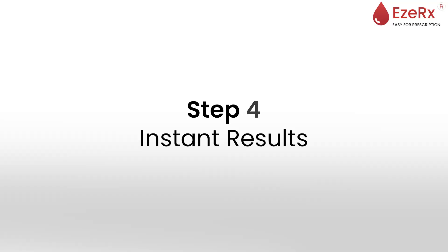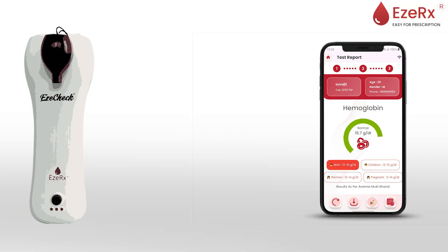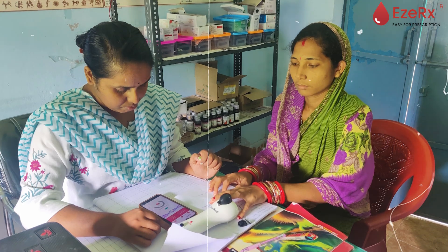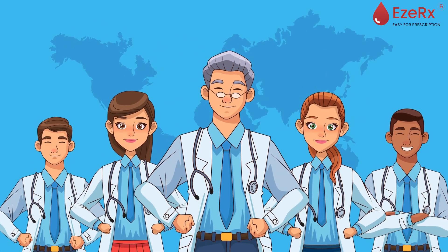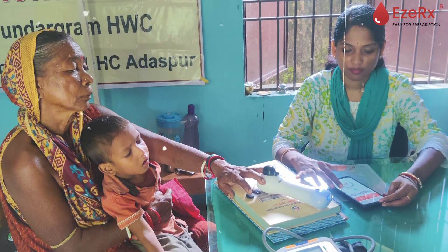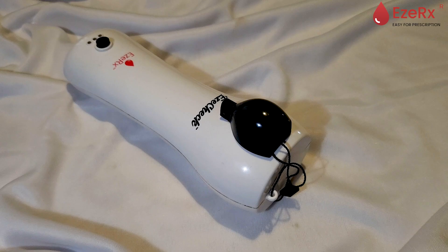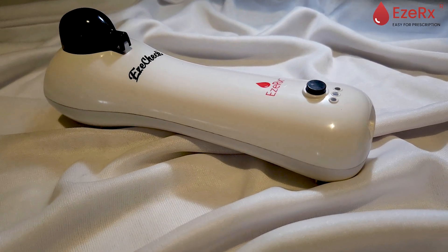Step 4: Instant Results. Within just 60 seconds, EasyCheck generates accurate hemoglobin readings. The results are displayed instantly on the device and through the mobile app. This instant feedback allows healthcare professionals to make informed decisions quickly, enabling immediate diagnosis and potential treatment plans. For the user, it means no long waiting times and no unnecessary stress. EasyCheck's efficiency makes it a game-changer in anemia screening, particularly in settings where time is of the essence.